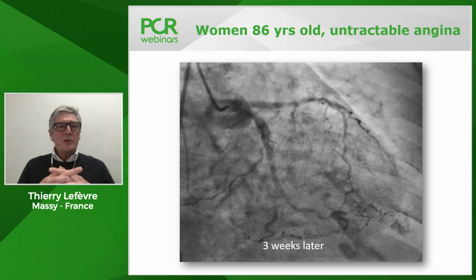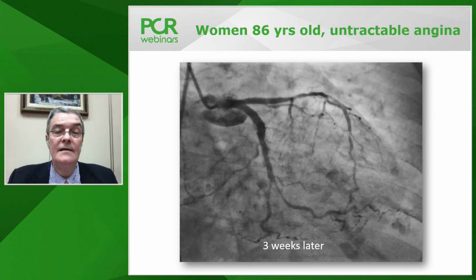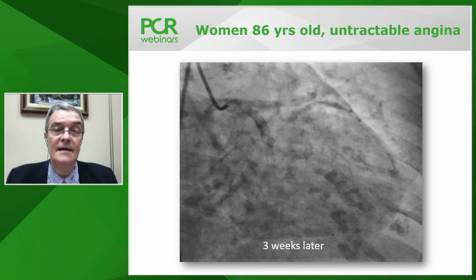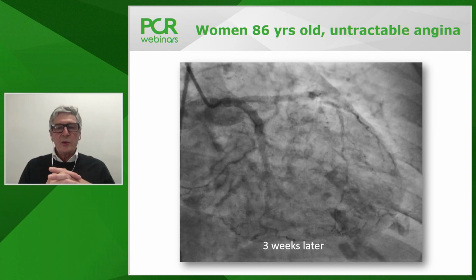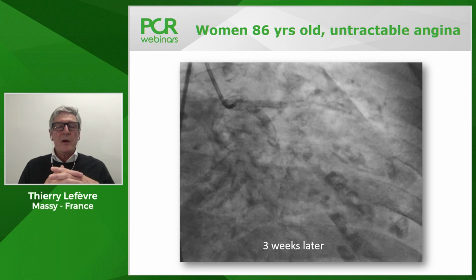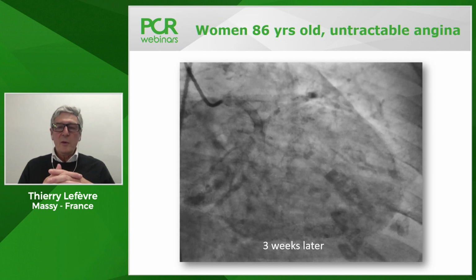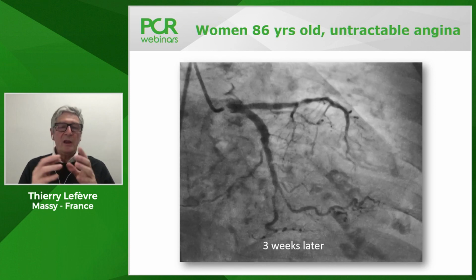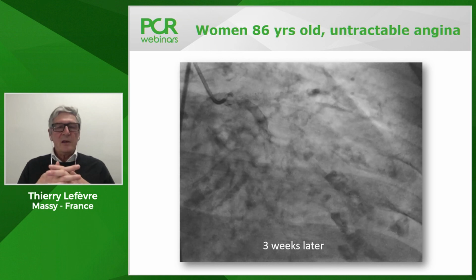The other question was on the IVUS imaging, whether you decided not to use it also after stenting. Yeah. So of course, it's a very important question too. I think it depends on your experience in left main stenting. If you are doing more than 20 left mains every year, maybe you don't need it in all cases.